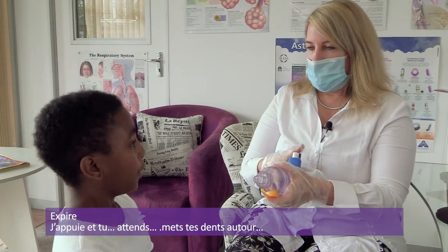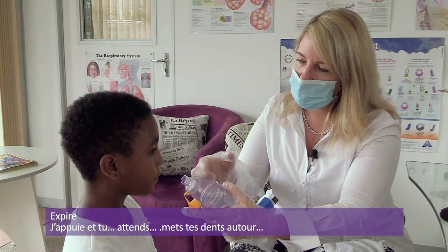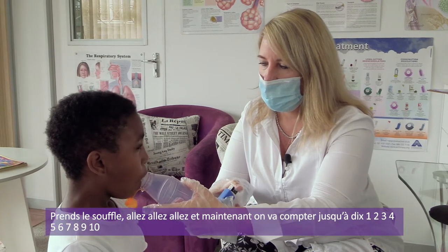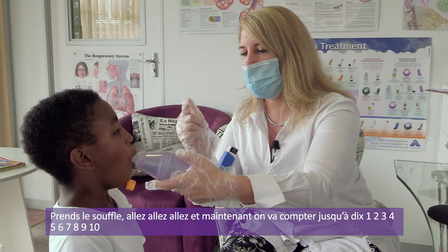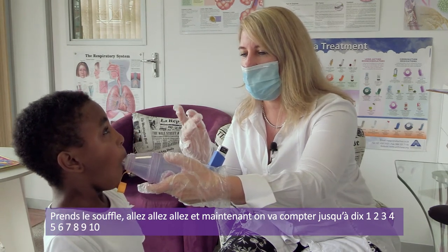Right, let's do the first one. So shake it up. Okay. Breathe out. Okay, press and suck. Oh, wait. Put your teeth right over it. Okay, breathe out again. Okay, put it in your mouth. Now breathe in hard. All the way. Breathe, breathe, breathe. Suck it in. Okay, now hold your breath. One, we're going to count to 10. 2, 3, 4, 5, 6, 7, 8, 9, 10.